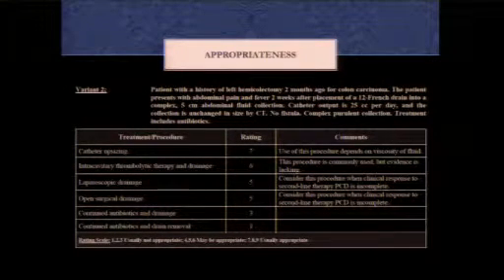So the second case is talking about a patient who has an intra-abdominal abscess that has a 12 French catheter placed in the collection. Drainage is minimal at 25 mLs per day, and it's not changing on CT. So in this case, they're saying that it's usually appropriate to upsize the catheter. This would basically be exchanging the 12 French for a larger, like a 14 French catheter, and this is supposed to improve drainage.